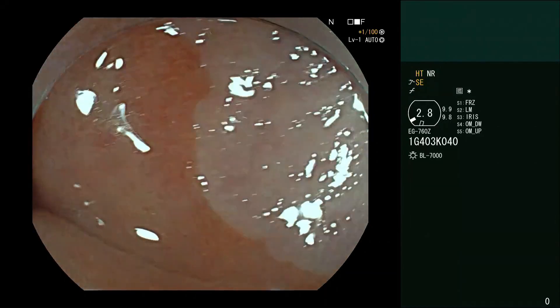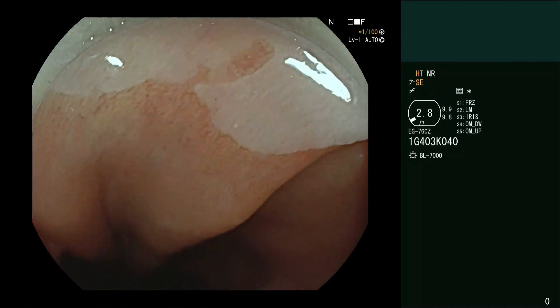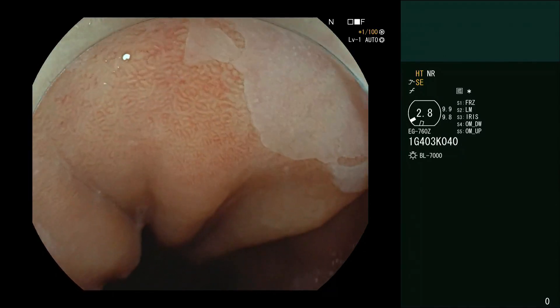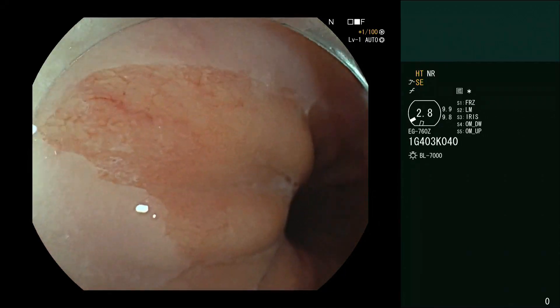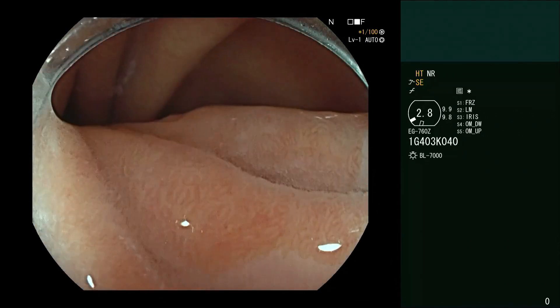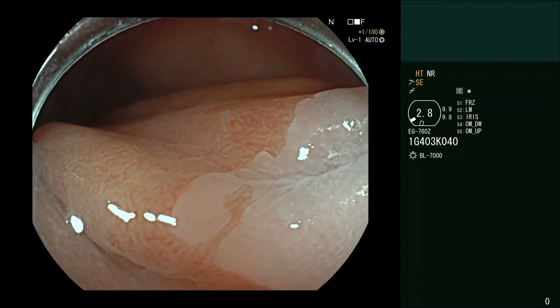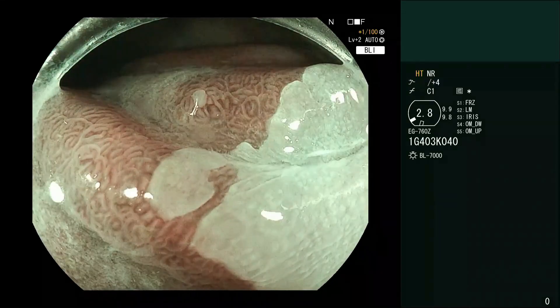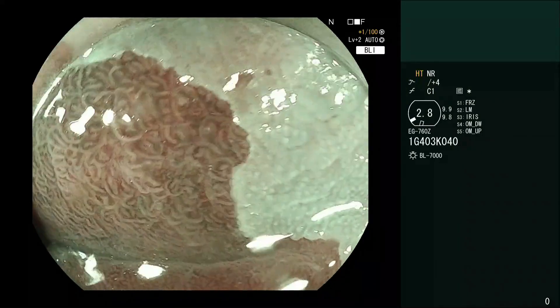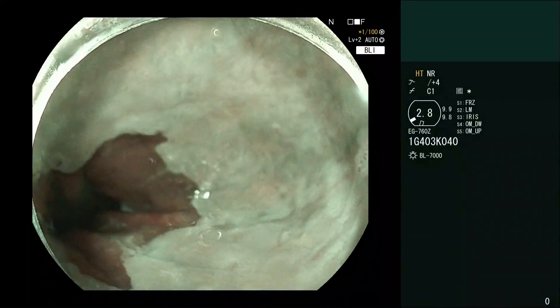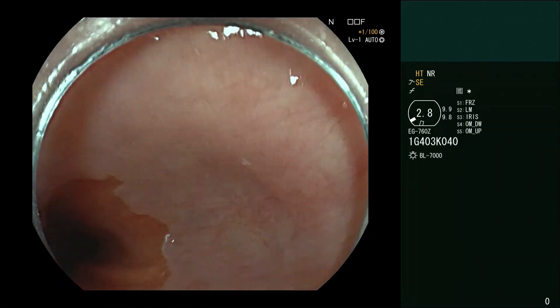You can use this to have discussions with your patients, but not if you didn't look. We can even use the magnification feature — not even the most high-resolution Fujifilm endoscope, e.g. the 760Z — to beautifully delineate this. If you have any question about the pattern, you can switch to BLI for better visualization. Here, we get the full vascular pattern and therefore the architecture of this zone. Having looked at that, I don't see any evidence of endoscopically visible reflux esophagitis.